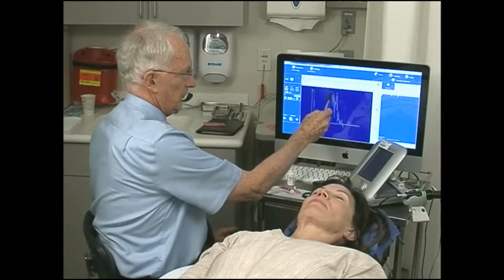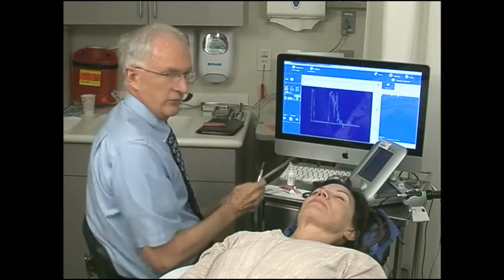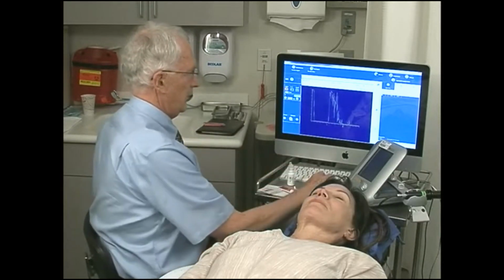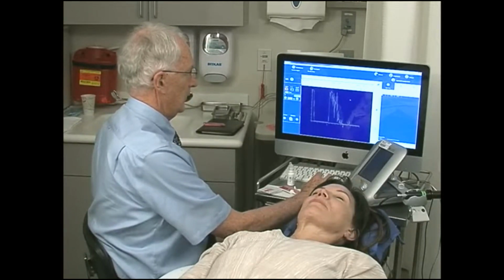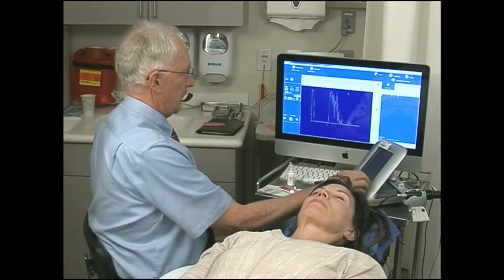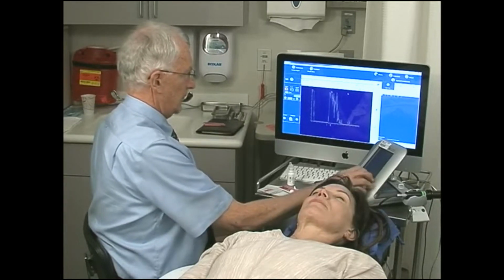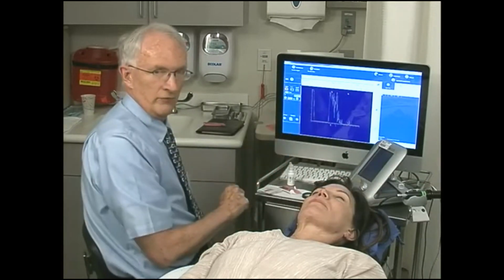So the muscle sheath, I'm going across the sheath from the inferior muscle sheath to superior muscle sheath, and I would measure that distance. We have electronic calipers and measuring tools to allow us to do that as we measure different structures. On this unit, I'm able to move the caliper and the cursor falls on the muscle sheath, and I then measure the other part of the muscle, and I display this as a thickness of the muscle.